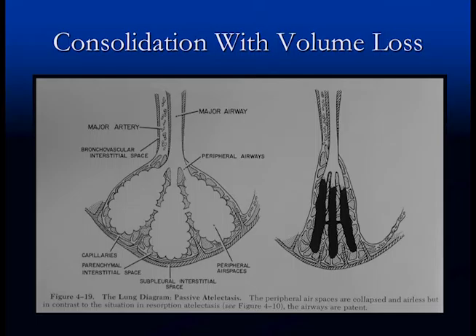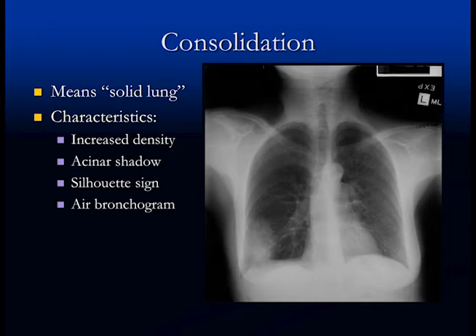Consolidation with volume loss looks like this — the normal is on the left and on the right we can see solid lung with soft tissue inside the air sacs, but there's also volume loss in that the lung is collapsed. Consolidation means solid lung.